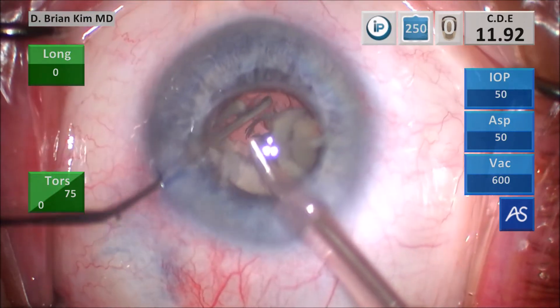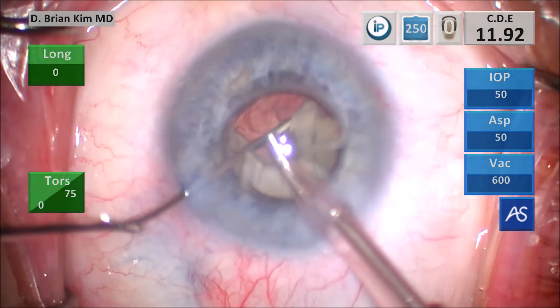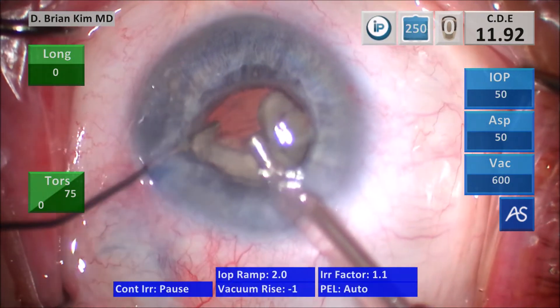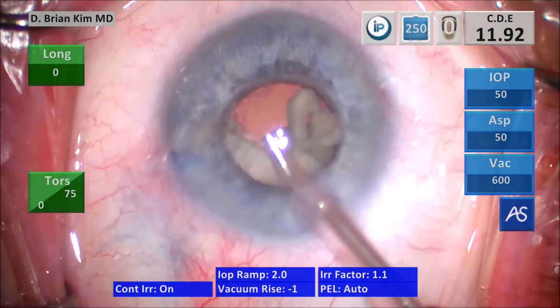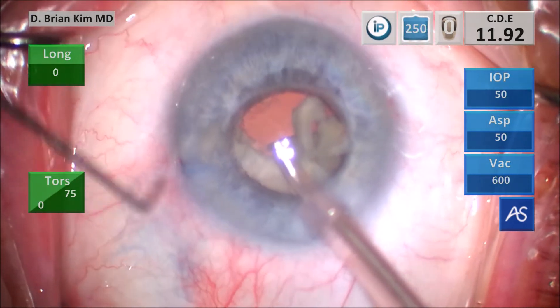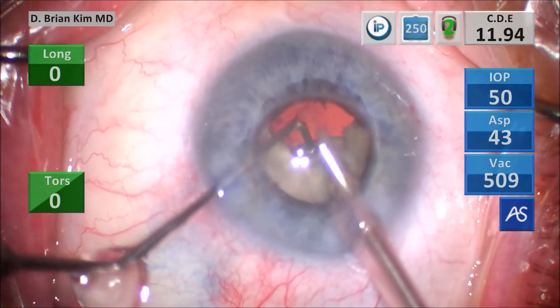I'm using the dispersive viscoelastic cannula to tease the lens pieces away from the defect, then I push the viscoelastic, creating a wall between the vitreous and posterior capsule defect and the lens pieces that are in the bag. I switch back to the chopper and I'm going to go ahead and try to bring these lens pieces up.